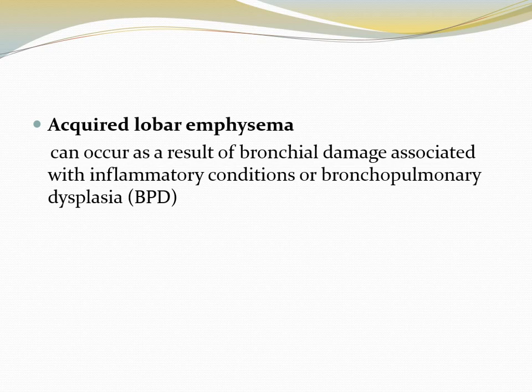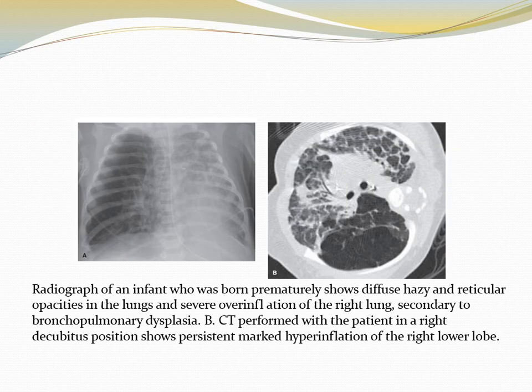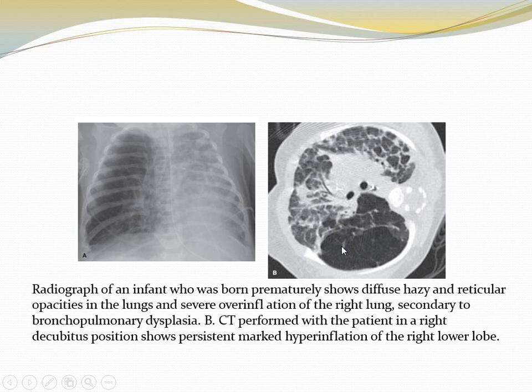Acquired lobar emphysema can occur as a result of bronchial damage associated with inflammatory conditions or bronchopulmonary dysplasia. In this case, a radiograph of a prematurely born infant shows diffuse hazy reticular opacities in the lung and severe overinflation of the right lung secondary to bronchopulmonary dysplasia. CT shows persistent marked hyperinflation of the right lower lobe only, compressing the rest of the lung. Surgical removal of that lobe allows everything to return to normal.